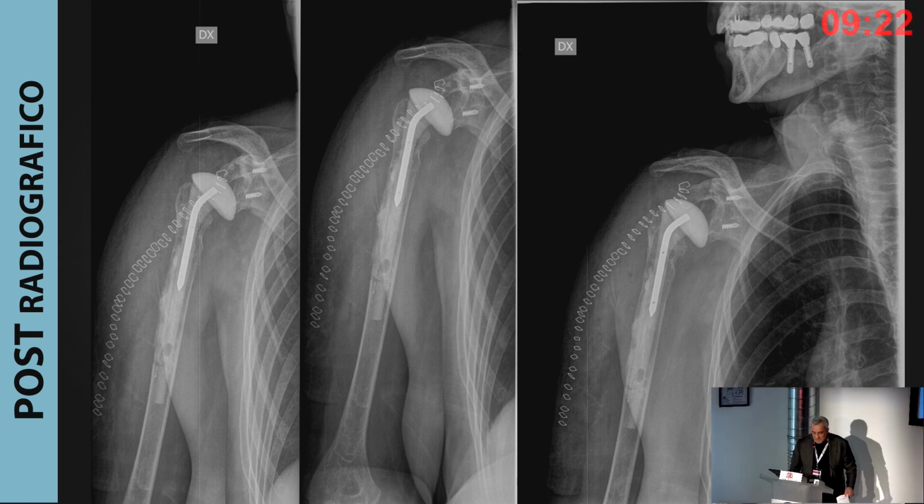Dr. Antuna, can you comment on this X-ray regarding the height of the spacer? We left some cement distal to the spacer and the 2 tips of the screw. What is your thought?